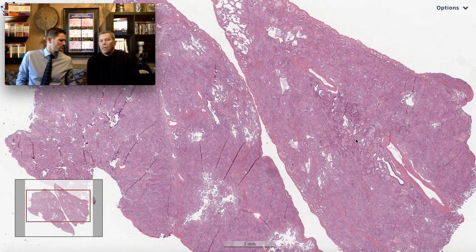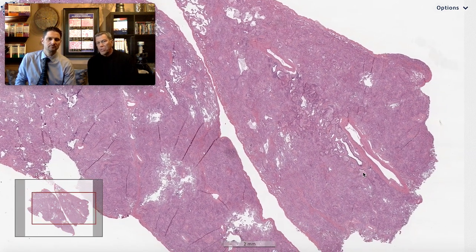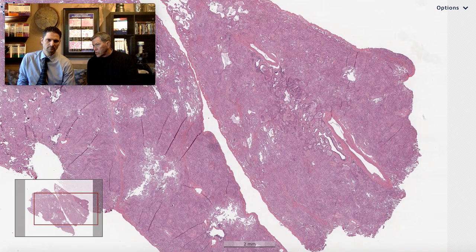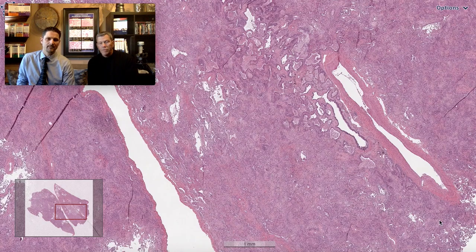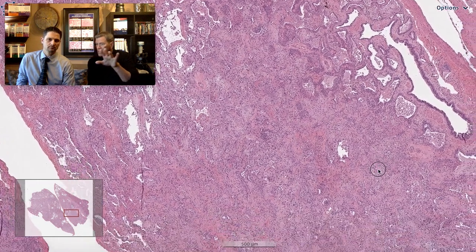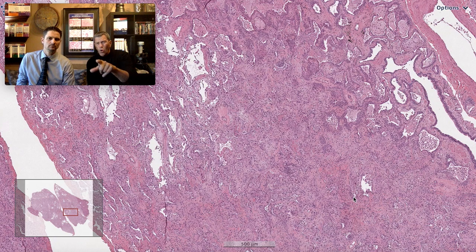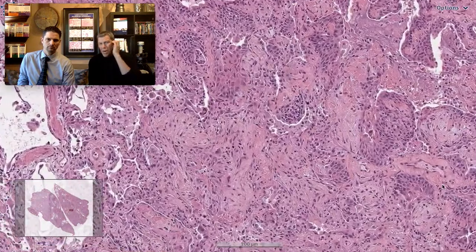You can see why there are ground glass opacities — you might even think, why aren't there consolidations? Because there is very little airspace here to look at. We're always in two dimensions under the microscope, and two dimensions may not be a realistic viewpoint for a three-dimensional structure like the lung, especially when you do a summation on CT of a millimeter or more of tissue. This looks diffusely abnormal with a few areas somewhat spared, and in the middle of all this mess, it looks like there are complex airway channels with mucus.